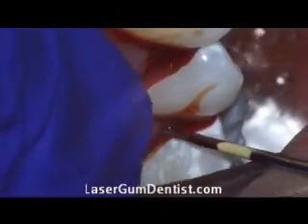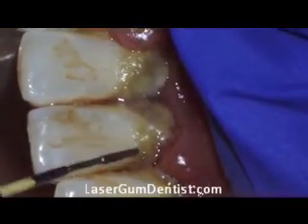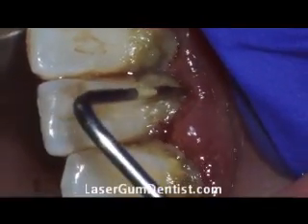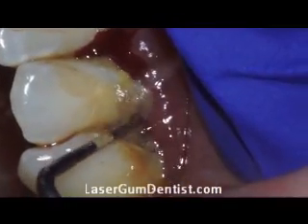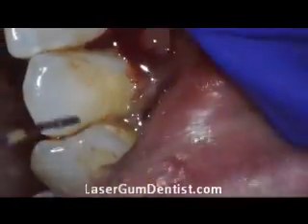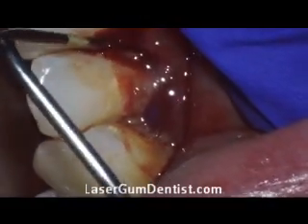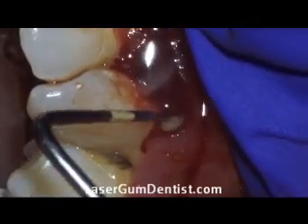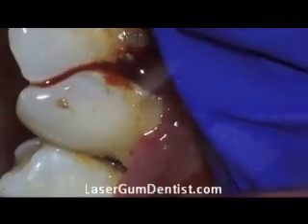If you look down at the description, I have more information about this case. You can also find this online at LasergumDentist.com. You can see the patient had quite a bit of tartar and infection, and the periodontal probe is showing that the patient had quite a bit of infection preoperatively. You can see we're going seven-plus millimeters — a very unhealthy site.